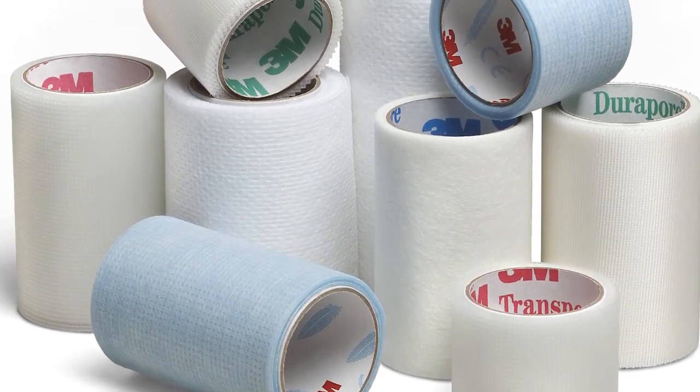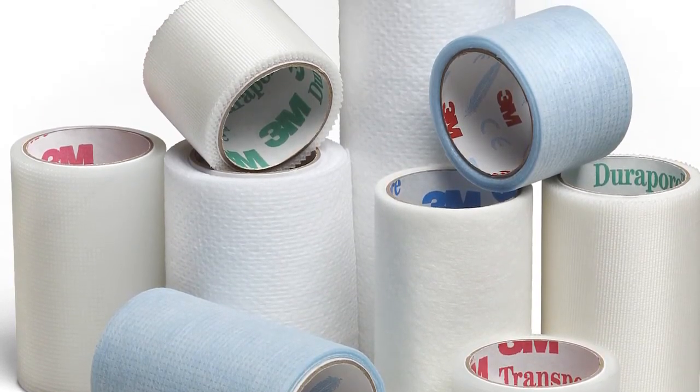So in summary, there is no one-size-fits-all medical adhesive product. The most appropriate tape for any application should be determined by the unique needs of the patient and the clinical situation. Exactly. These are all important factors in selecting the proper medical adhesive to use.